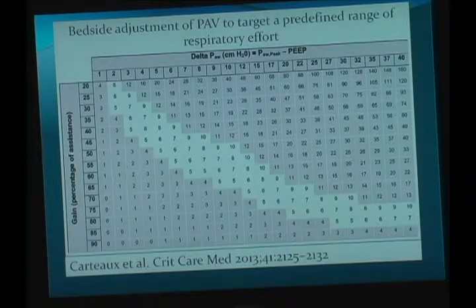This is a good point from the clinician. From the clinical point of view, you can select the calculation of the machine that says, if I support this much pressure, I can understand that the rest of the effort done by the patient represents a certain amount of work of breathing.